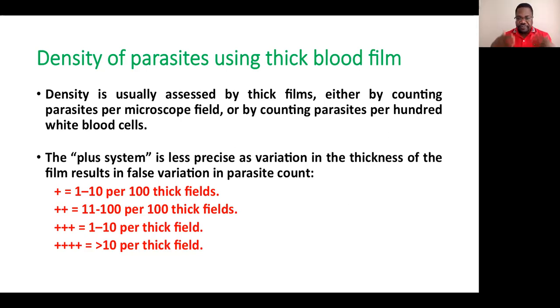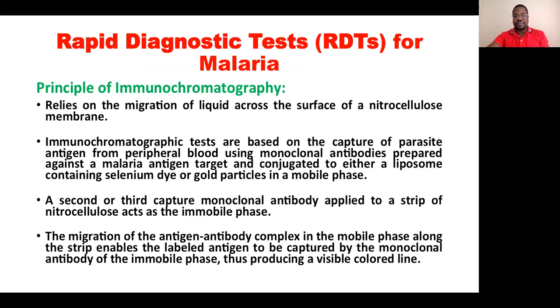Okay, so it gives you an idea, but this method is less precise if you compare it with the density counting method we use with the thin smear approach. So that is the microscopy testing. You can do it with a thin or thick smear.